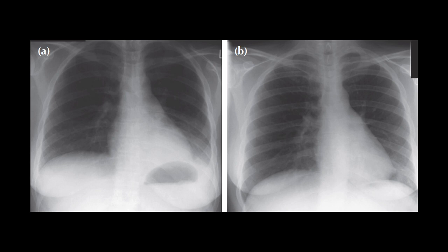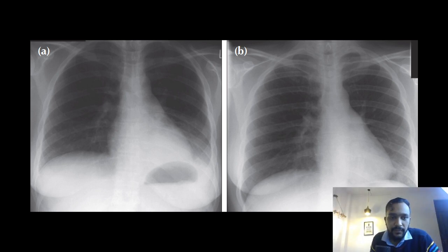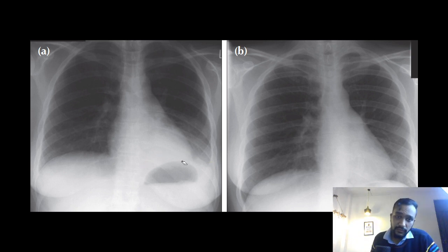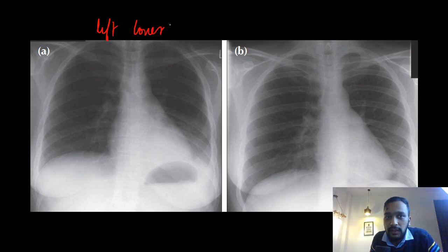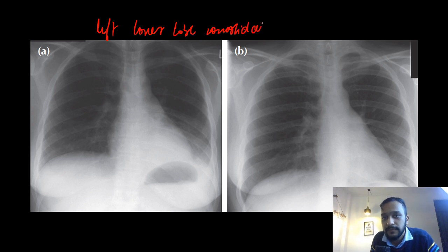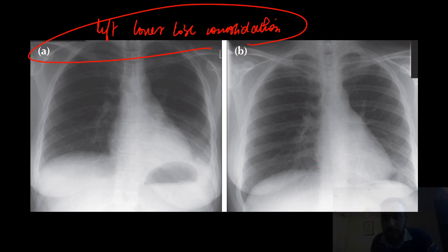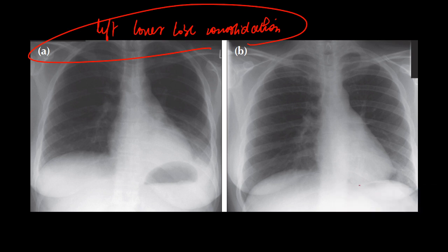...you will see that the left dome of the diaphragm is not visible in this patient. If the left dome of the diaphragm is not visible, it means there is left lower lobe consolidation in this patient. After treating this patient with antibiotics, we can see that the left dome of the diaphragm is very clearly visible.